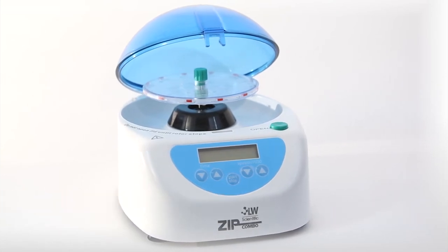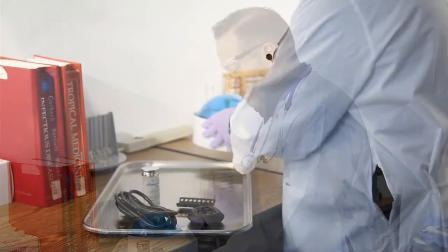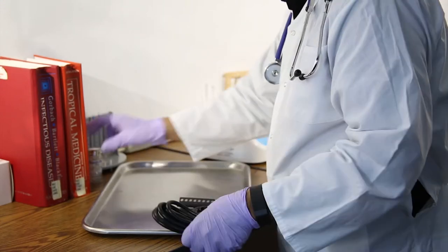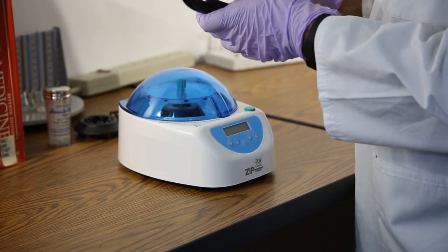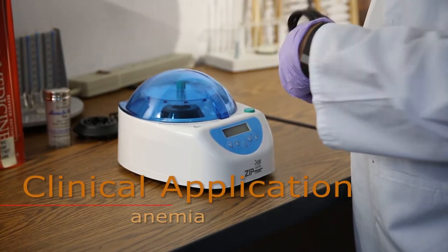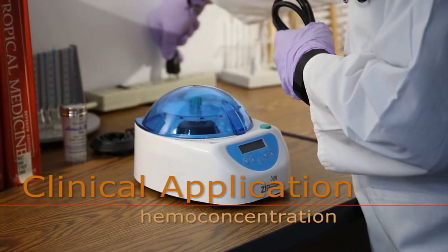Hematocrit centrifuge. The hematocrit is a measurement of the ratio of the volume of red blood cells to the volume of whole blood in a sample of capillary or venous blood following centrifugation. The hematocrit is used to detect anemia, polycythemia, hemodilution, or hemoconcentration.